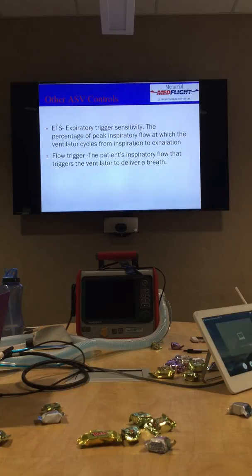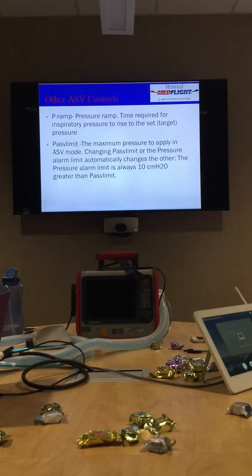Just because it's defaulted, we set all of these vents exactly the same. Whether Pete's Transport or MedFlight, they are all set up exactly the same. So if we're down in ER and you guys are down there and want to help us with that, hey, we're more than happy to let you help. I've played with your vents once. I know you have. So that's what I'm saying. Feel free to jump in and say, hey, I got this for you because you're really busy.